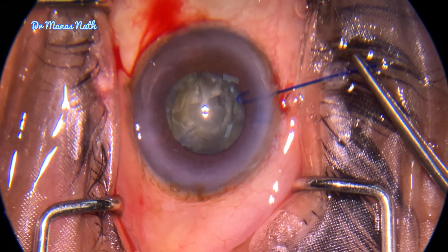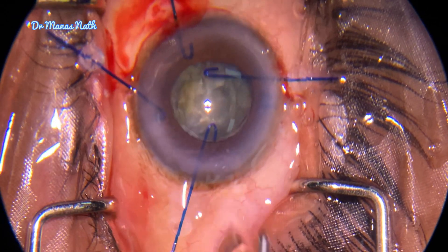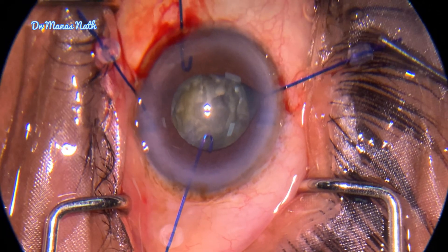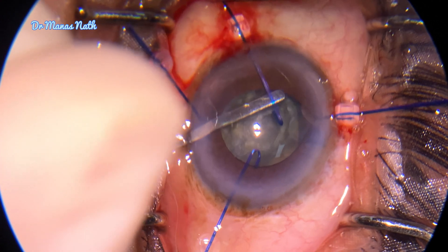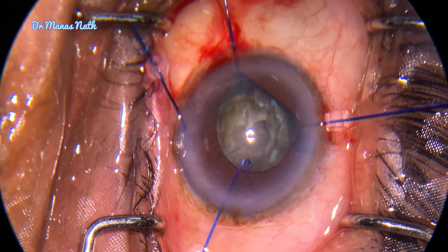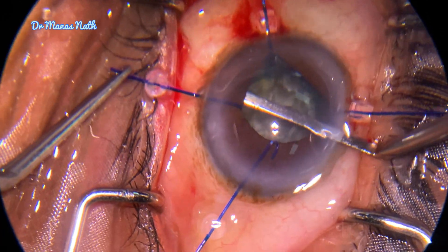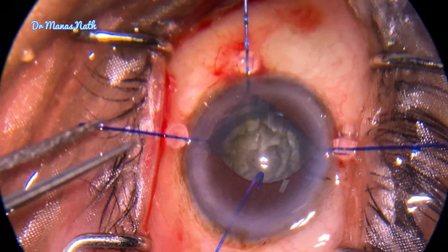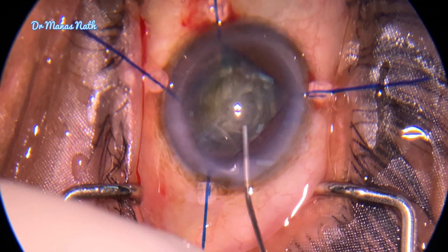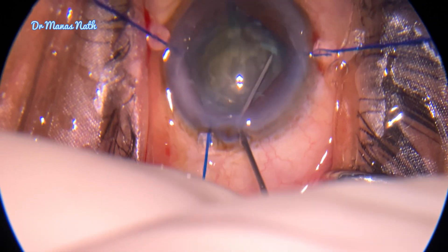With iris hooks, I used four iris hooks. As the capsulorhexis is there, one should not drag the rhexis margin. One can always use a spatula to lift the iris and hook it up. I used the fourth one. No obvious zonular dialysis was found. I did another hydrodissection here.